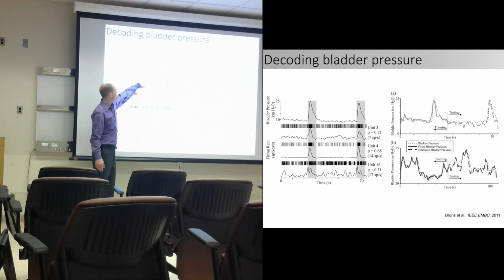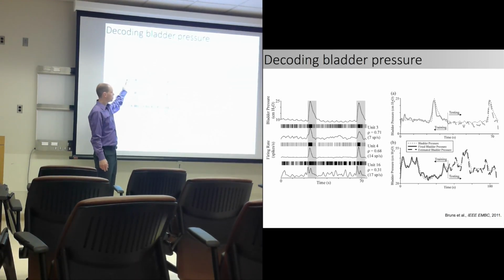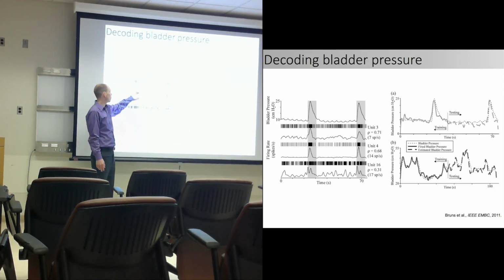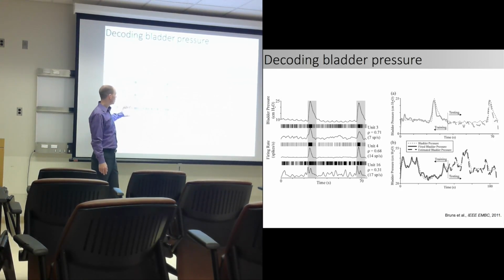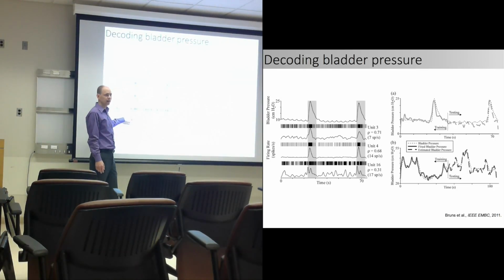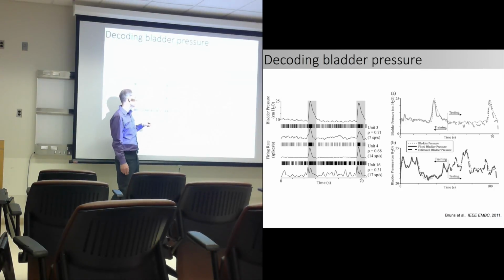So it's the same bladder contraction, and here is the action potential rate, looking at just a moving average over time. So we call this the firing rate of the neuron, for one neuron and then two others that have varying levels of how well they fit the data. Then at the bottom is a pretty noisy recording. Highly likely that this is multiple neurons and you can't differentiate among them. But there still is some information in here that overlaps.